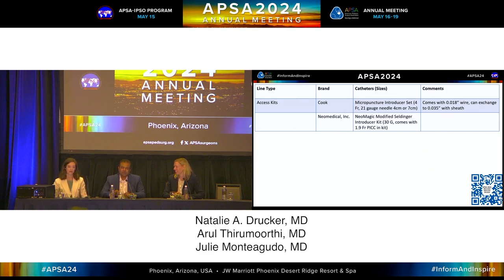It's a really good point. I know exactly what you're trying to say, the yellow plastic one. It also comes in the Broviac kits for the smaller ones. It's useful, yeah.